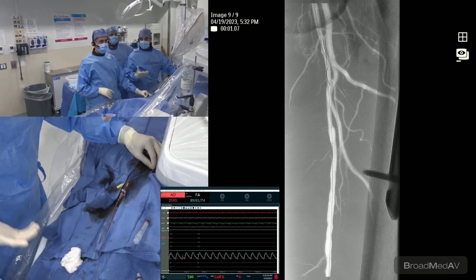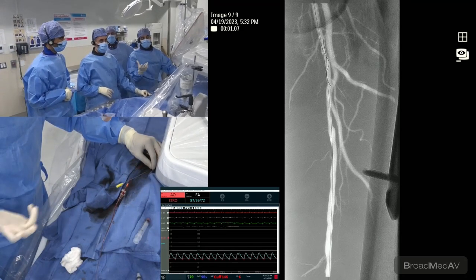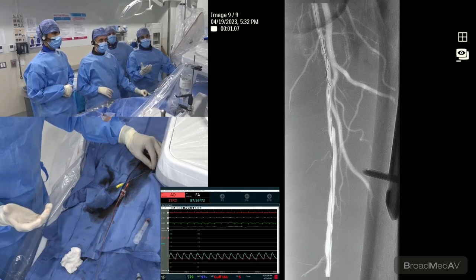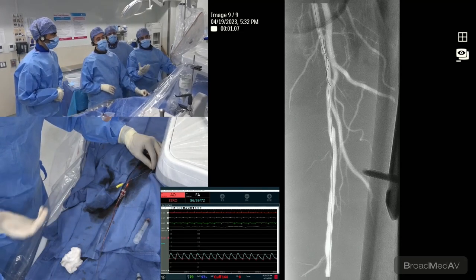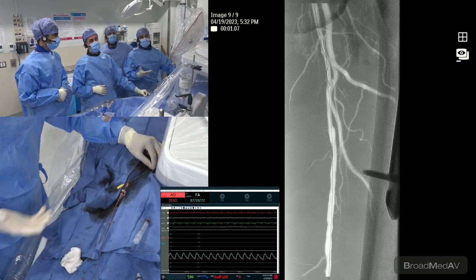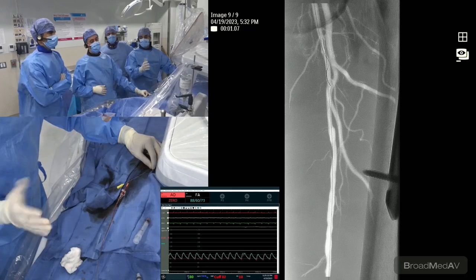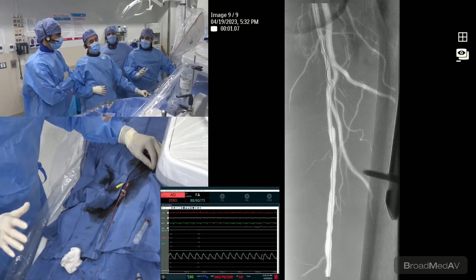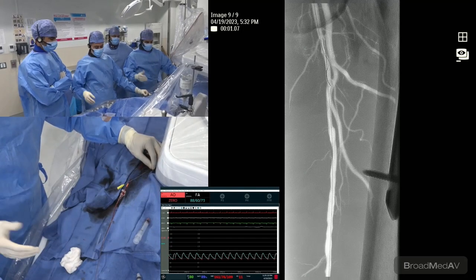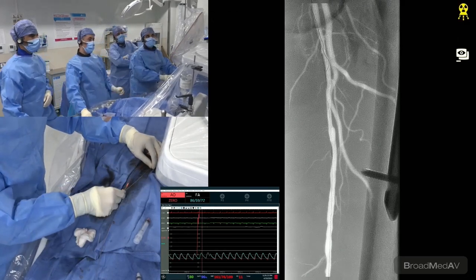The real question for me is if we choose to do this proximal lesion, this is one that will likely result in needing at least some form of a scaffold, and it will be a relatively long lesion, at least 120, 140 millimeters. I guess it depends on how far along you go. How much do you really want to commit to treating this, knowing that it really only contributes a 10 to 12 millimeter gradient across the entire lesion?